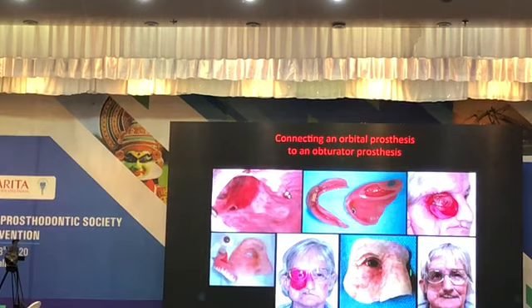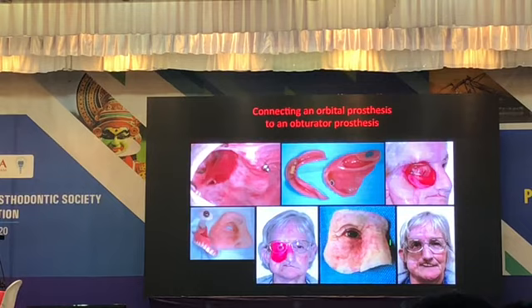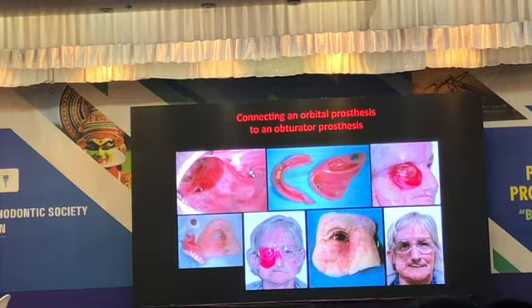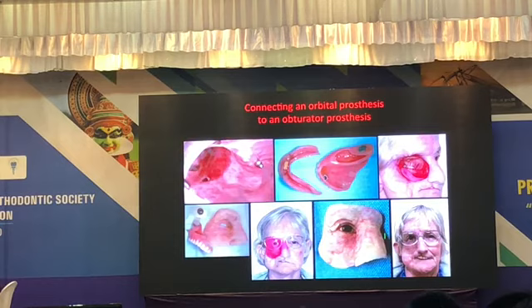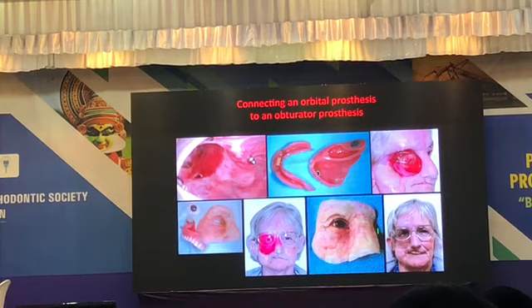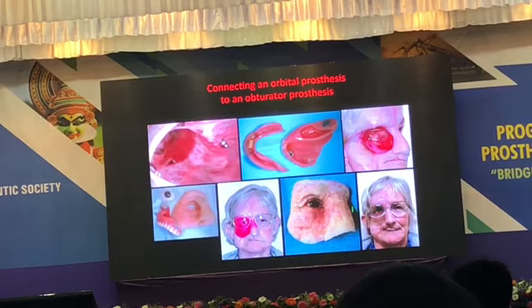Gives you an idea of how well these patients function, how they can function with an appliance. So she had a maxillectomy, so half her upper jaw is gone. And she has a big orbital prosthesis. And I don't think any of you could probably tell from the movie that she had a large orbital prosthesis. And so this is the kind of outcome that you would expect if you're going to provide this kind of service. And this is the level that you should try to achieve.